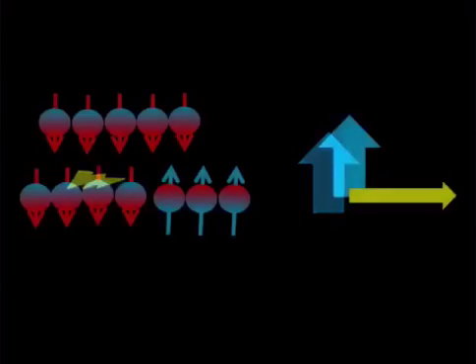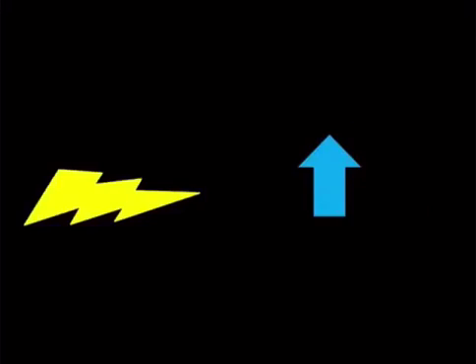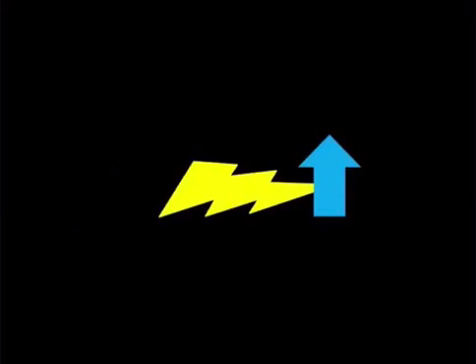So a small arrow is only going to have a small flip angle. Notice that it's only coming down to about 30 degrees. We'll run this again. See where it's going? Stops right about 2:30. Stopping right about there. That's a small RF pulse. What about a big one? All the way down to 90. See the difference? So flip angle depends on the amplitude and the duration of the RF pulse. So more and more of those little hydrogen magnets turned in opposition to the magnetic field with a bigger pulse. That makes sense.